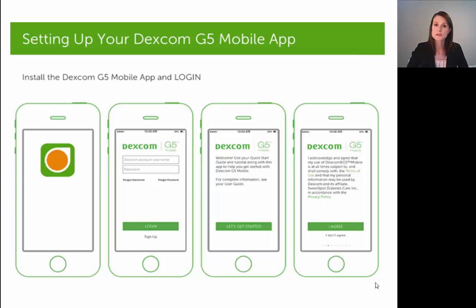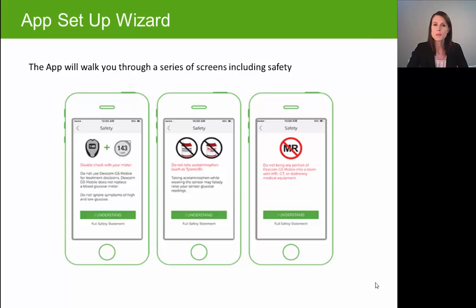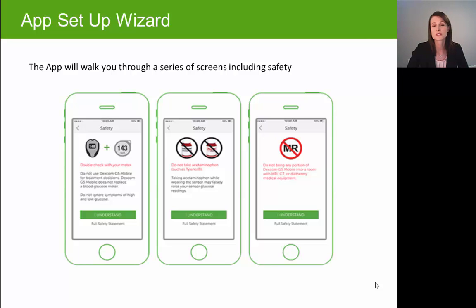Once you've successfully logged into the G5 app, you'll click on the 'Let's Get Started' button and then agree to some terms of use. The app will then walk you through some precautionary statements about your Dexcom system. The first being that you want to make sure you use your glucometer in conjunction with your Dexcom system, particularly when you're determining any kind of treatment decision.